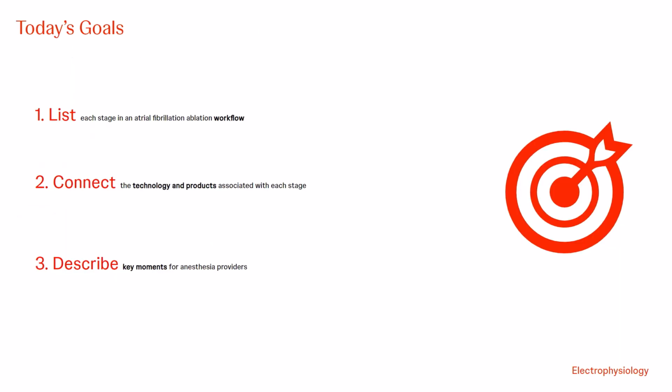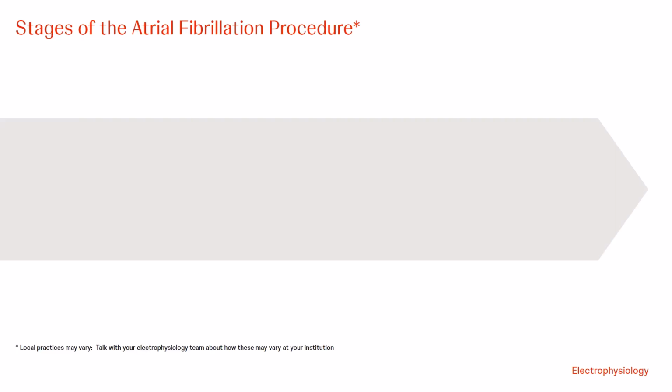By the end of today's presentation, you should be able to do the following. List the stages of an atrial fibrillation workflow. Connect relevant Biosense Webster technology and products with each stage of the procedure. And describe key moments during the atrial fibrillation ablation procedure.